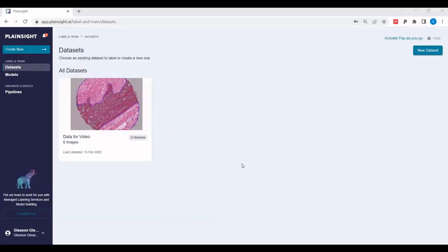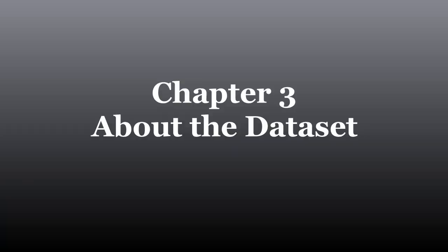In this study, we ask you to annotate diagnosed tissue microarray images of prostate cancer and select appropriate explanations. You can interrupt the study and continue at a later time. That's not a problem. The only important thing here would be to finish and submit the image you are working on.